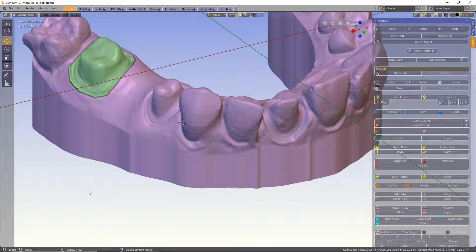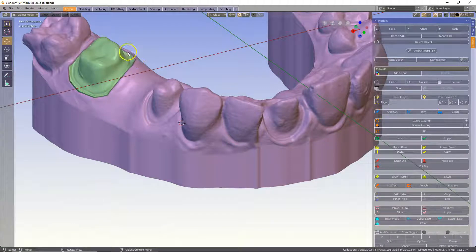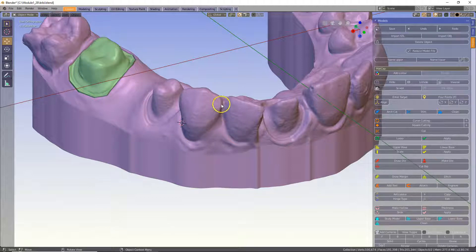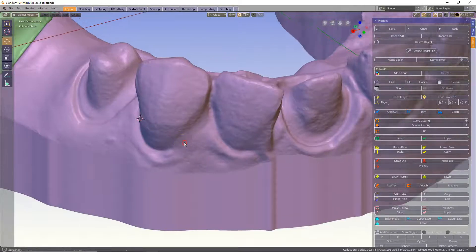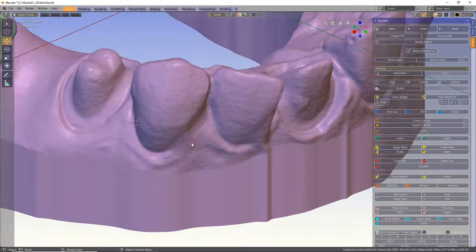In this video I'm going to demonstrate how to make dies from individual teeth. We have previously learned from a different tutorial how to make dies from preps. Individual teeth are a little bit different because their contacts are very undercut in some cases. So this is not included in the module and the model designer. However there's a few steps involved.